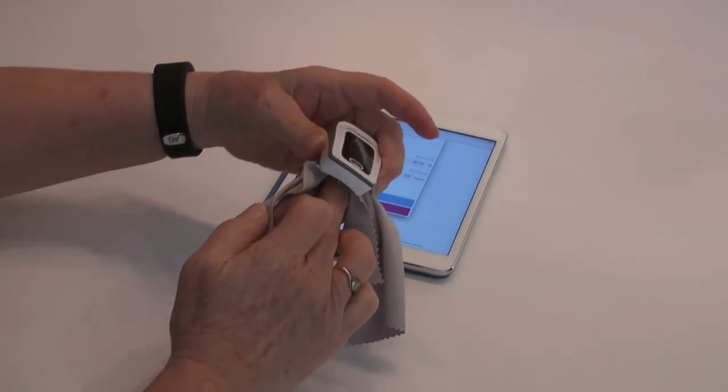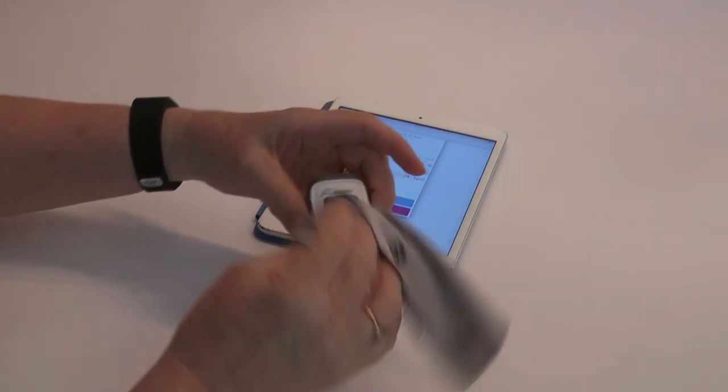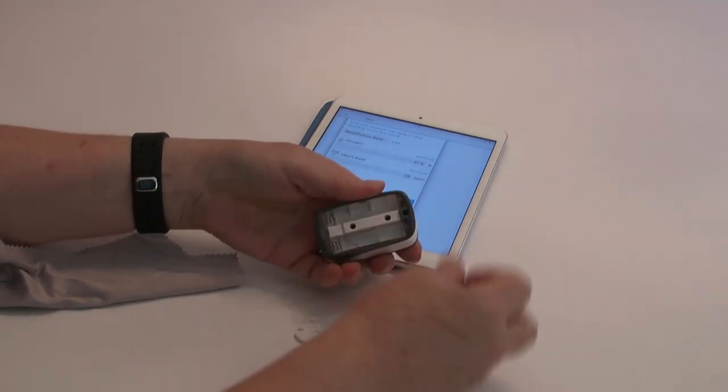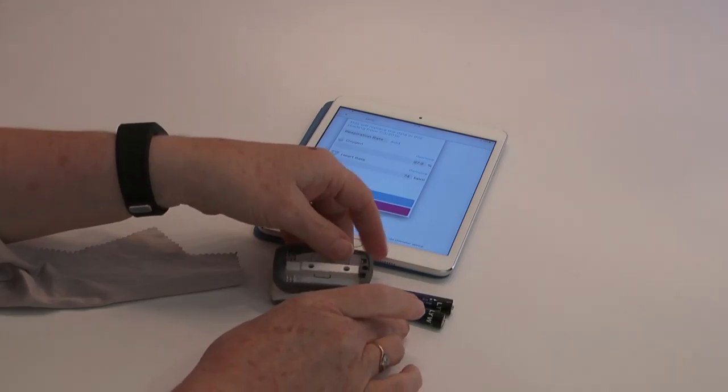The Pulse Oximeter 2 has several parts: the OLED display, the on-off button, and the battery compartment. It comes supplied with a storage bag and product manual.